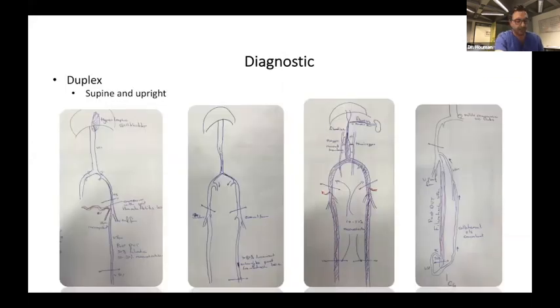These are some examples of our venous maps, which I received from Erwin Thunder, again, our duplex specialist or technician. You see really visualizing the deep system and the superficial system. He visualizes for us the chronic venous obstruction, the collaterals, the reflux. Reflux is drawn in red color. You see, this is the reflux. So just consider this picture. This is an acute DVT due to a chronic venous obstruction in IVC. So these are really brilliant venous maps, which make life easier, and we can easily make our indication, and of course in combination with a good imaging, other imaging like MRV or CTV.